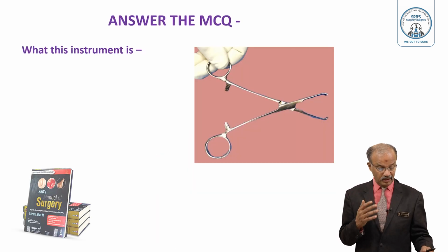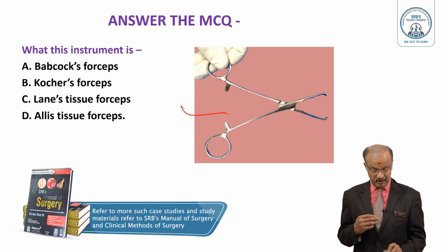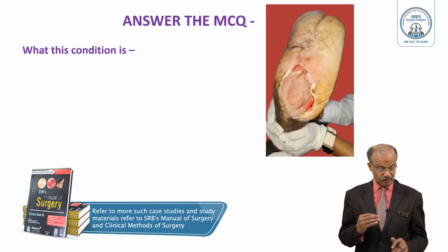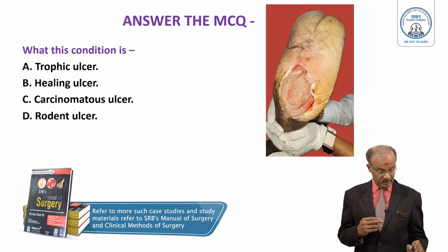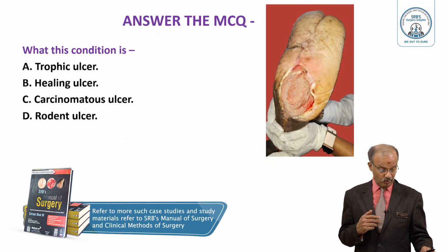And students, answer the MCQ: what is this instrument? A, B, C, D, find out the right answer, and I'll appreciate your answer. Another MCQ: what is this condition? A, B, C, D, find out the right answer. I will appreciate your answer, put it in the comment box.